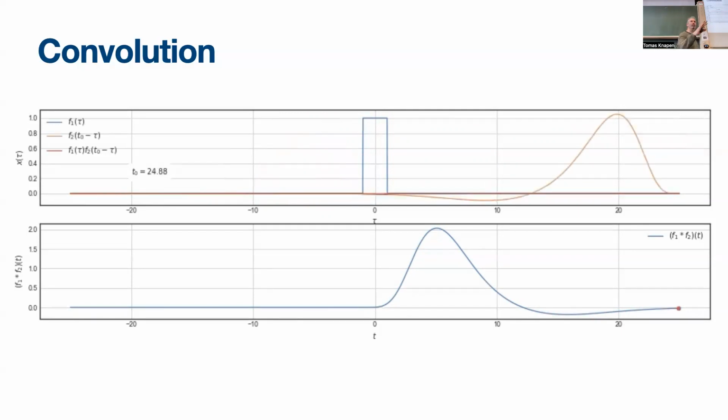There's math involved, but I'm keeping it out for now. By assuming this hemodynamic response function and saying that this is the time at which my neurons activate, by performing this convolution, I can predict the time course of the BOLD response that I expect to find. Those are the different steps here.